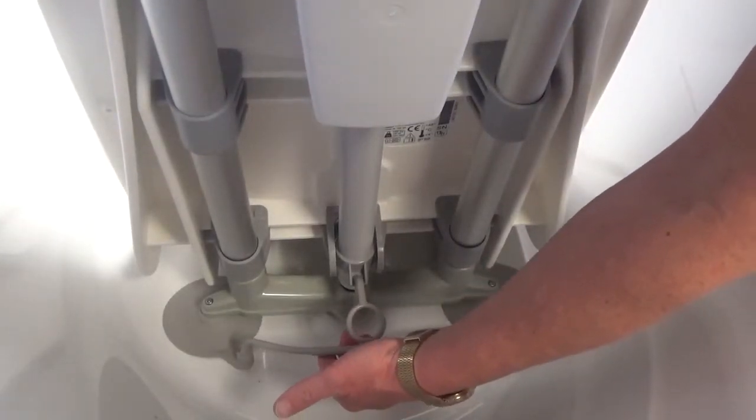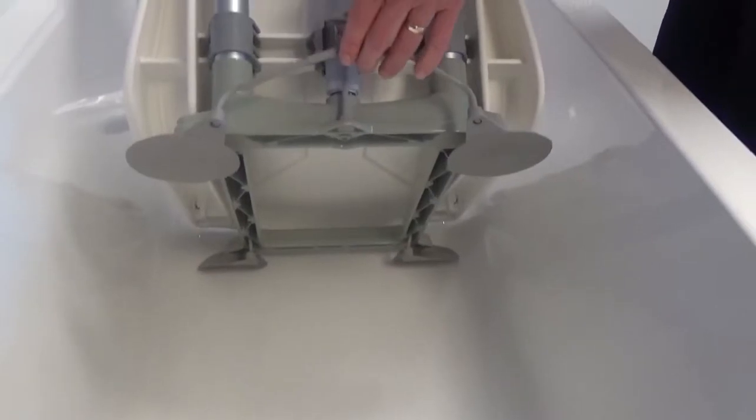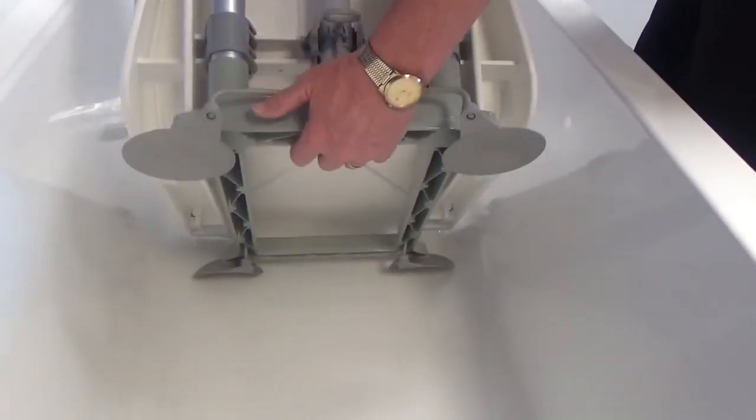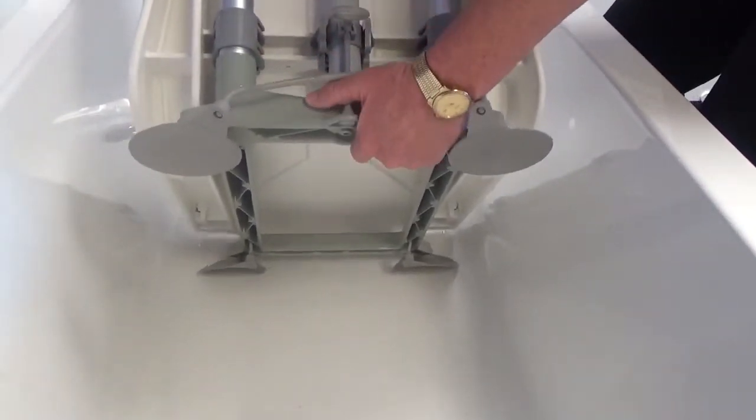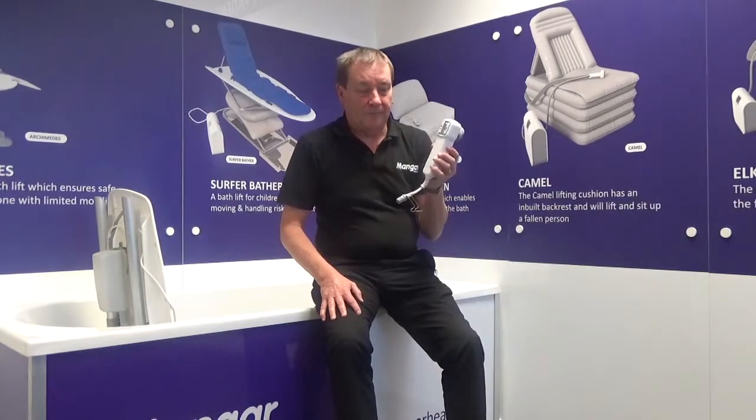This line here, if I hold it, move the bath lift forward, the air goes behind the suckers and the bath lift easily moves forward. If I change my grip now so that I'm holding the frame, I can now lift the whole 10.5 kilos quite easily. Of course, with the handset being a battery unit, it will need recharging.